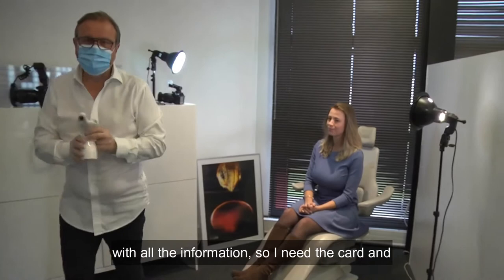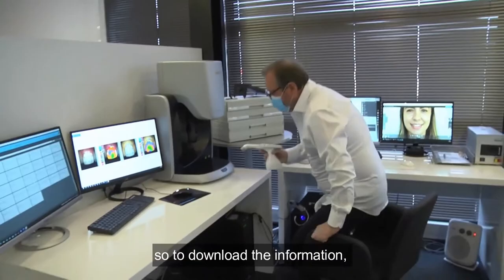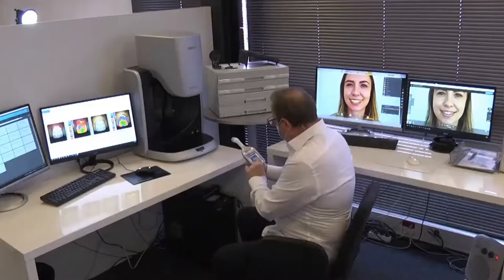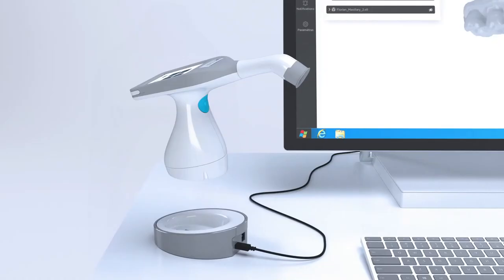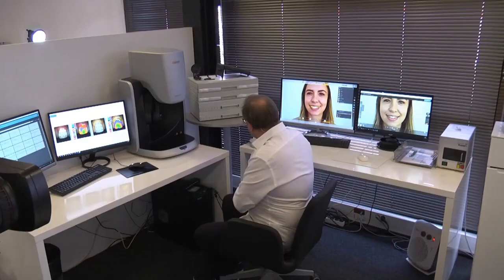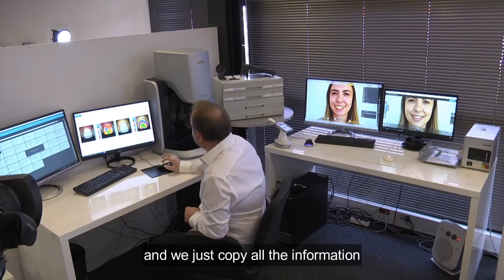I have all the information — the card and the shape — and we are going now to this area. To download the information it's really easy: I just put one click, I have the base, I put my replica on it, open the software, and we just copy all the information and download it.